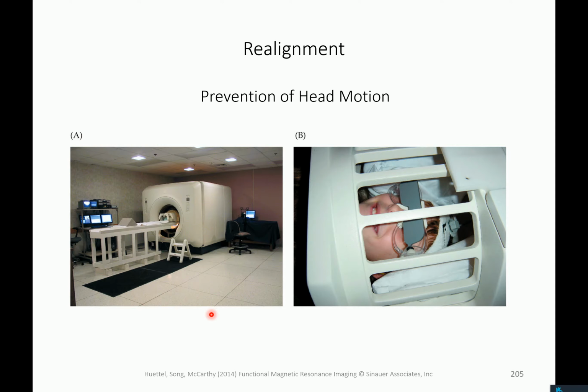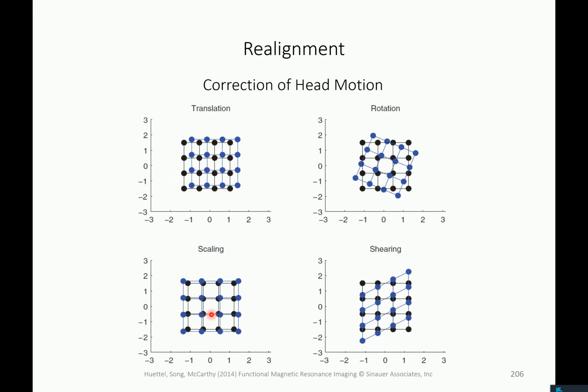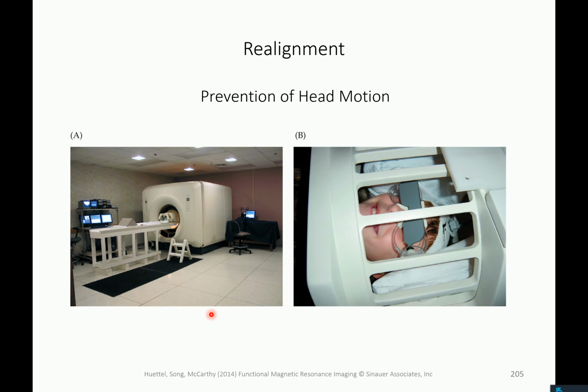Usually the common participants are, of course, your fellow scan students, so also we don't have a mock scanner here. You will not train them, but encourage them to stay still. Even if they stay still, there's some residual motion, for example by the heartbeat, which pumps blood into the head, and there's a little bit of movement associated with that. So one needs to correct for that.